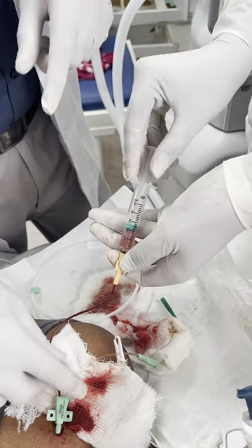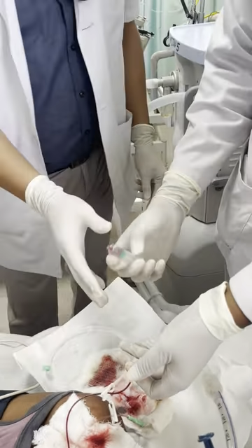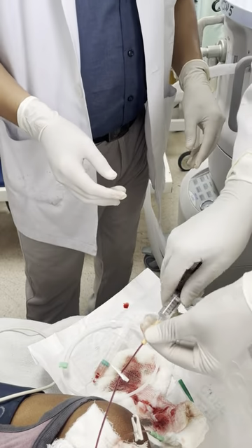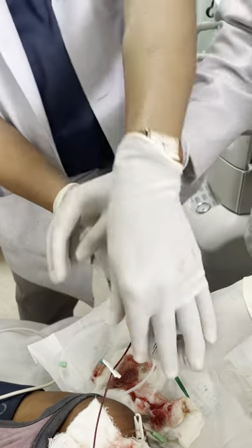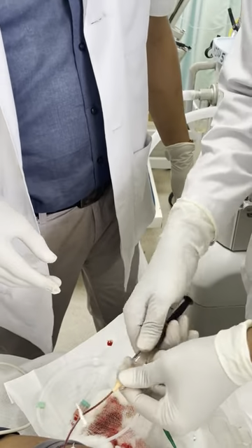So now what will you do? You will lock it. So you will remove the air, then you will push it. Okay? And at least put 4-5 ml. See, this is also equally good. Again, is it without air? Without air. Not without air. There is air. Okay. Now push it. In peach color.